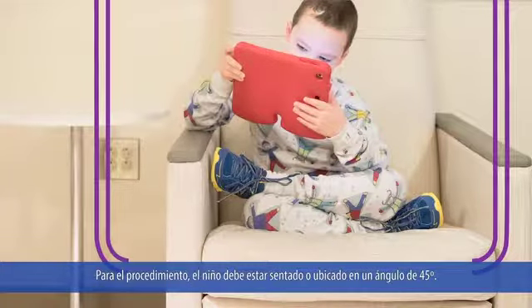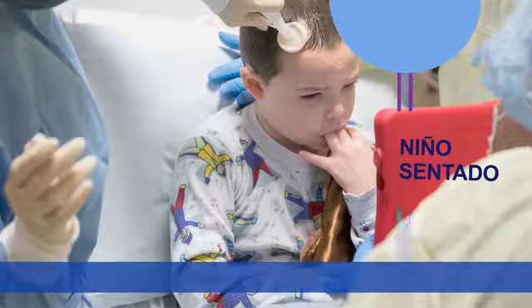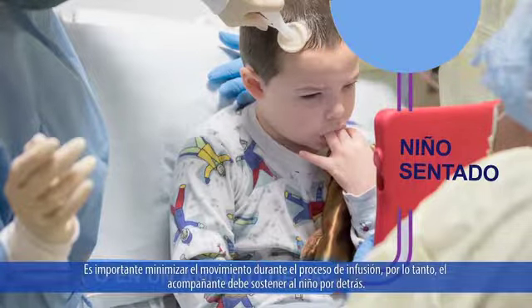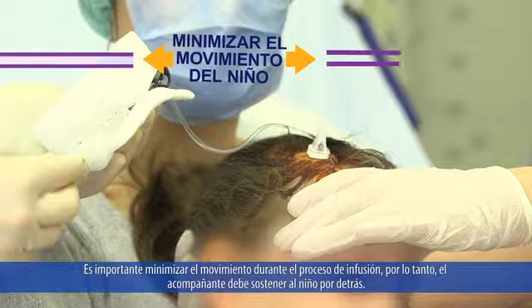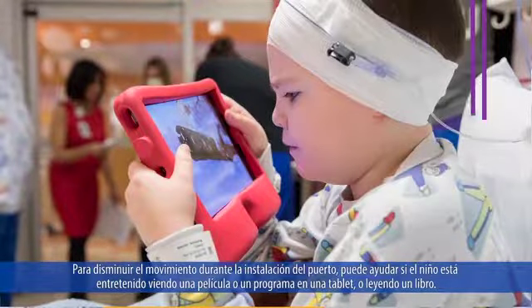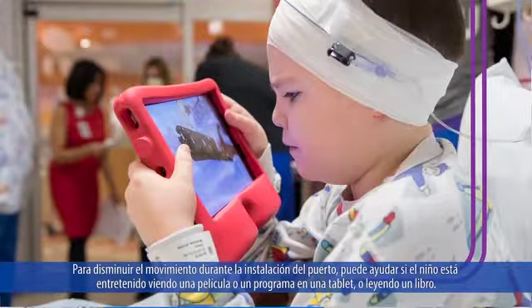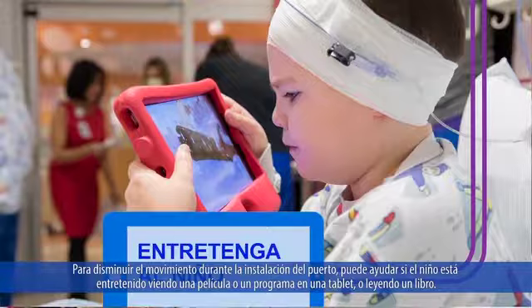For the procedure, the child should be sitting up or positioned at a 45-degree angle. It is important to minimize their movement during the infusion process, so have a caregiver hold them gently from behind. They may help keep the child distracted to further minimize movement during the port access by showing them a movie or TV on a tablet or reading a book.